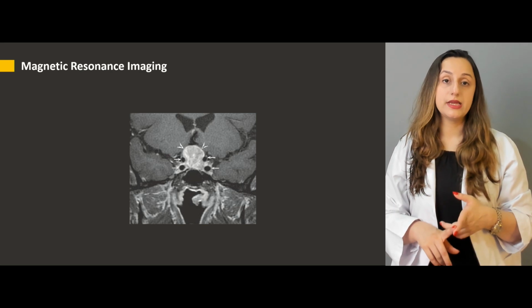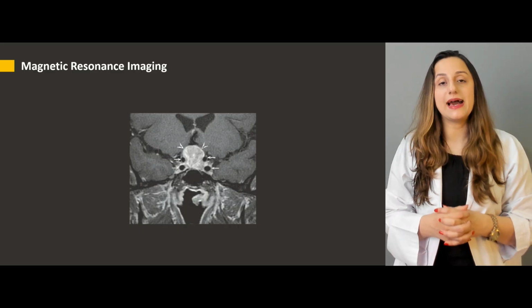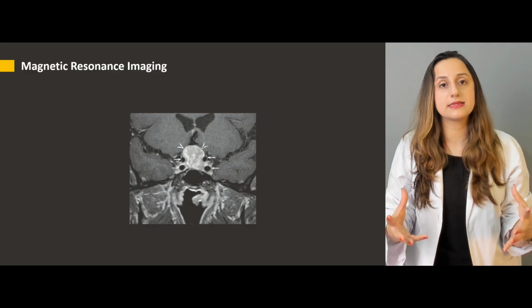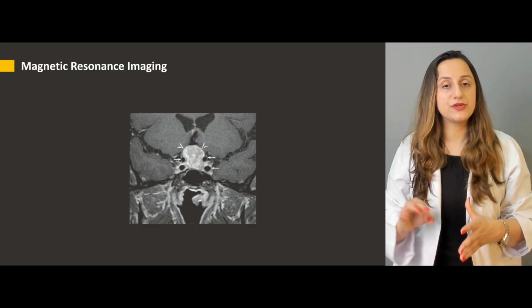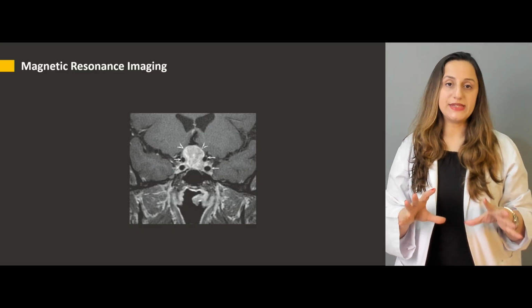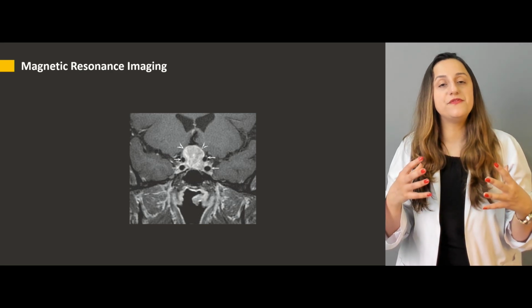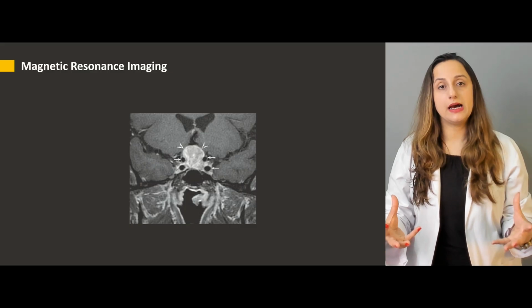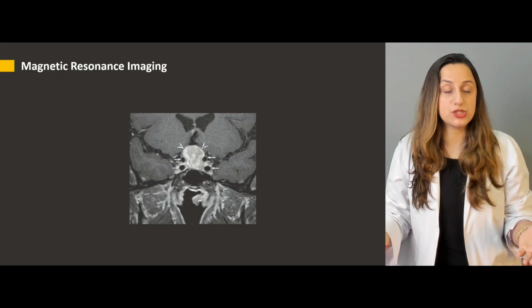Contrast injection is also quite importantly seen over here. It has to be a homogeneous kind of mass that is present over there, just to identify whether it's a pituitary adenoma or not. So these techniques are basically the main resorts over here, and it's also going to be very helpful for you when you are planning a transsphenoidal surgery for the patient.